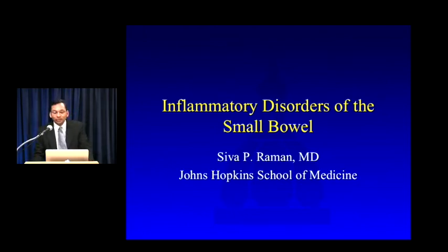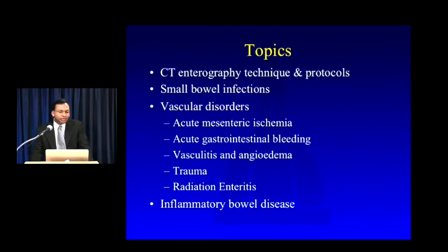Now, over the course of this lecture, I'm going to talk a little bit about inflammatory disorders of the small bowel. We're going to begin with a brief introduction to enterography technique and some of the different protocol options that you might utilize in your own practice. But I'm going to concentrate mostly on pathology, and specifically three major categories of small bowel inflammatory pathology that I think come up relatively frequently in clinical practice.